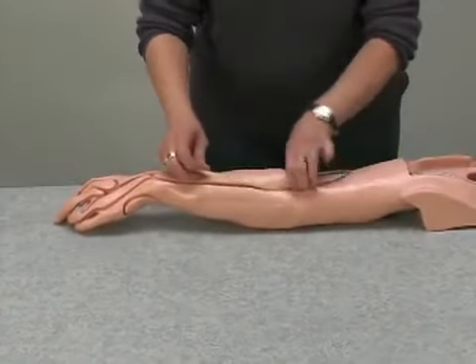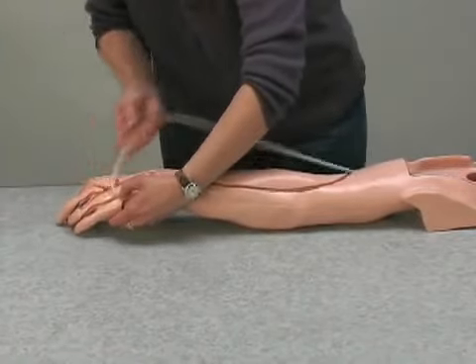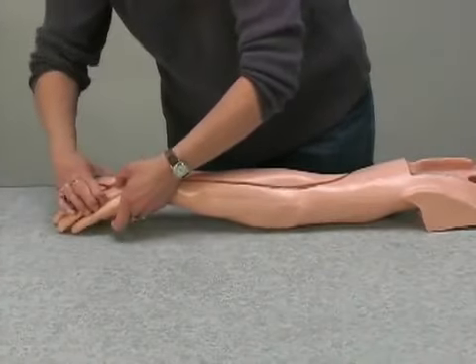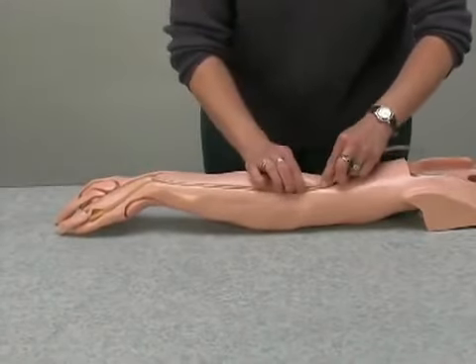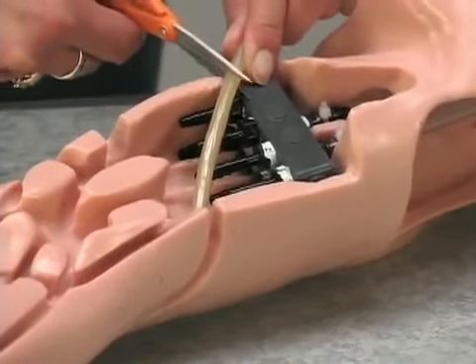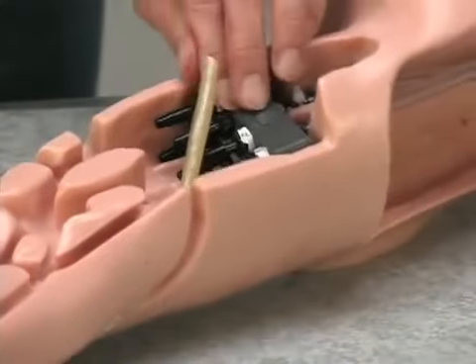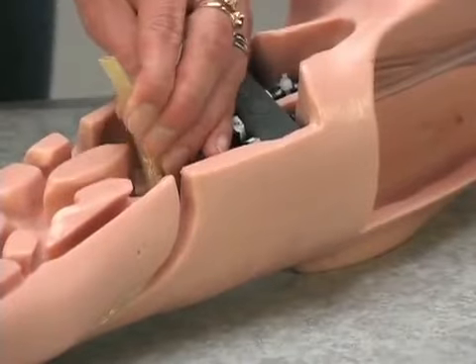Work the tubing into the channel over the back of the arm, around the third finger from the inside, and back over the arm in the same channel. You will need to trim the excess tubing, being careful not to cut the vein too short. Lubricate the loose end and connect to fitting number 4.